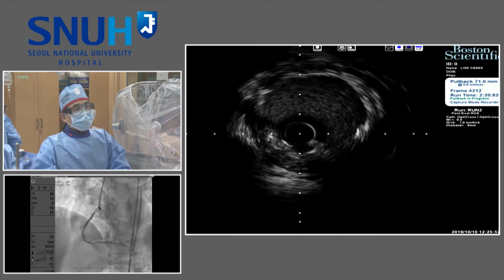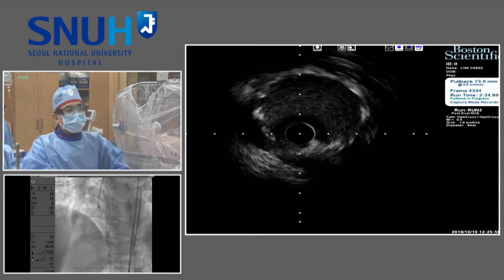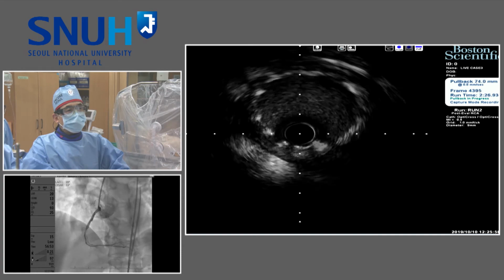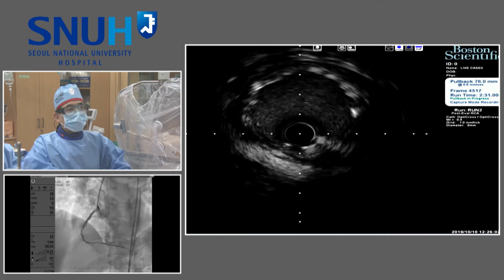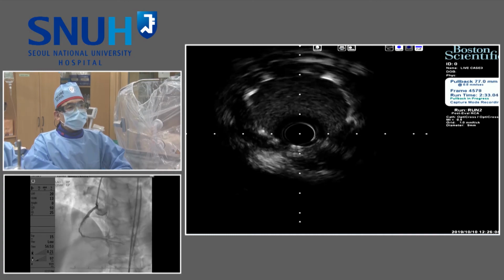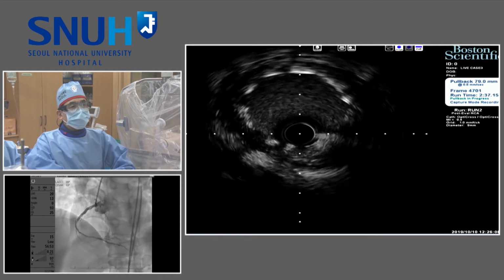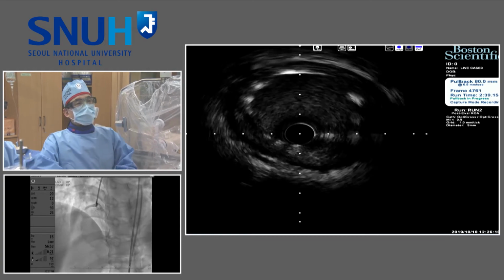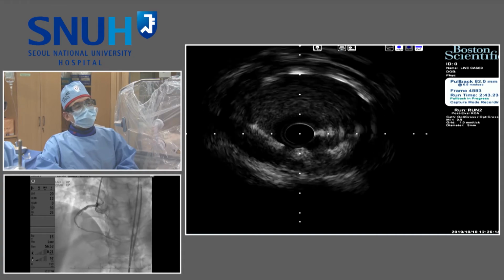I think it's probably better to just take a short stent, not to oversize too much, and bring the patient back in the future to do an angiogram to see how much of the negative remodeling has disappeared. I think you have done an excellent job in getting this result so far. I think the 2.75 and the short stent is a good choice for this patient.